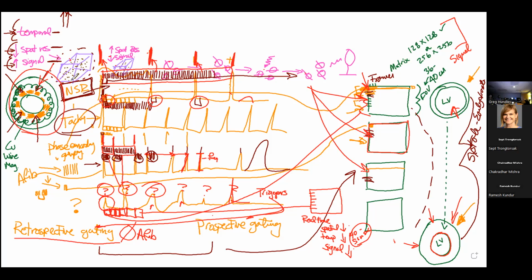However, not all patients show up with a heart rate of 60 beats per minute. And how we're organizing the collection of those images has got to change when we deal with tachycardias. We organize our image acquisition where we create the pictures with fewer lines of our matrix. However, we're buttressed in that because the heart rate is twice as fast. See in this next row. So the duration of the breath hold does not have to change. And it's all set up for you guys at about 6 to 8 seconds of time that participants hold their breath.